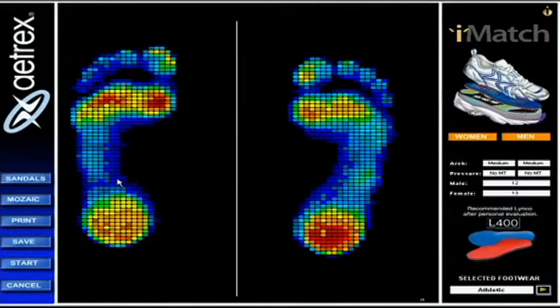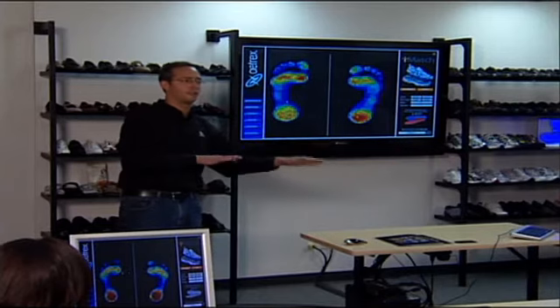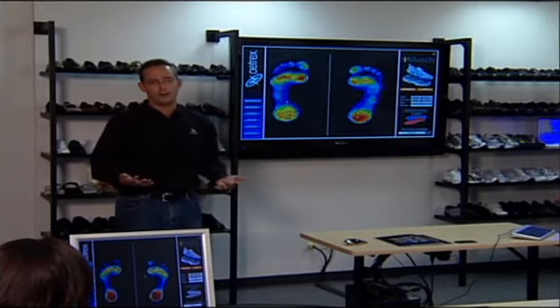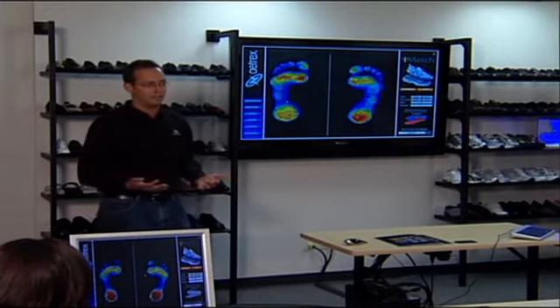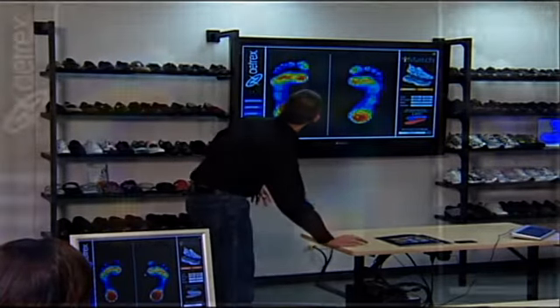Where do you think that median line might be helpful? Really to see if the patient is standing too far to the left or the right — also with center of gravity, which is a feature we can turn on later.